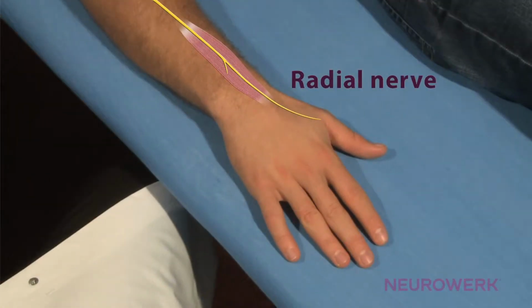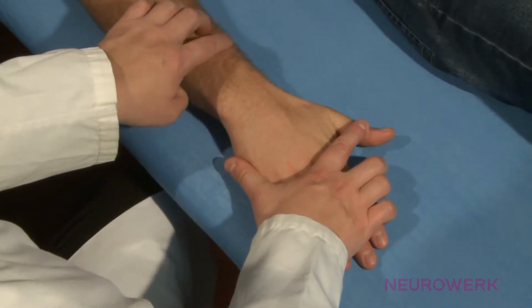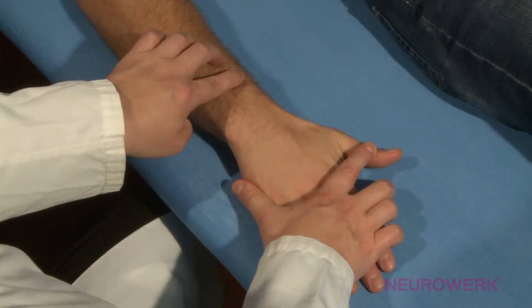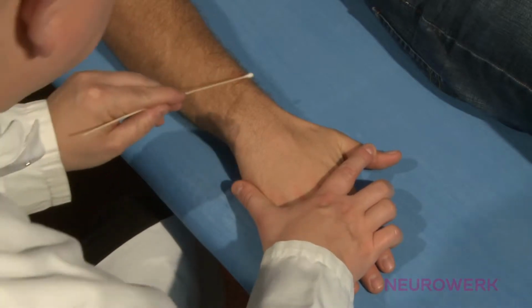In the motor neurography of the radial nerve and following this examination method, the different or active recording electrode is positioned above the venter of the abductor pollicis longus muscle. Examining the motor neurography of the radial nerve is more difficult than the neurography of the median or ulnar nerve due to the course of the nerve.